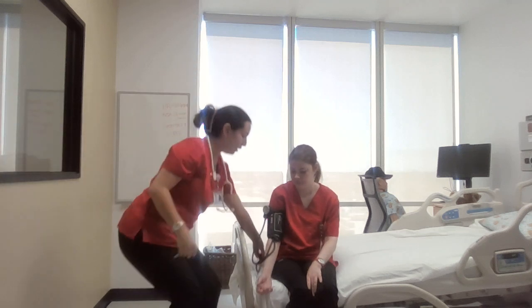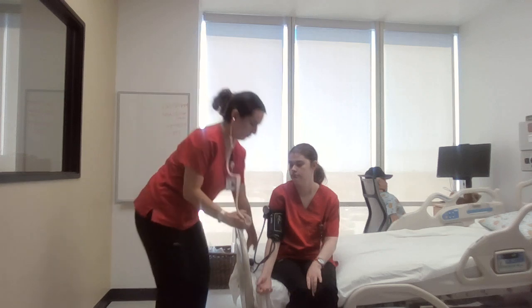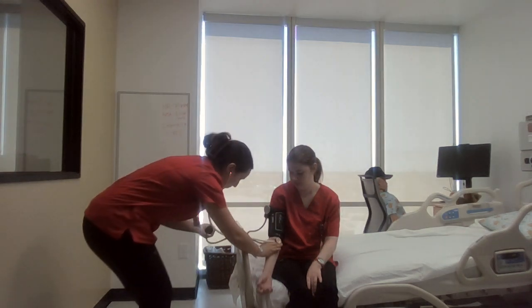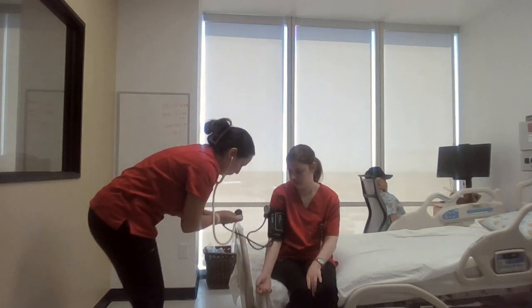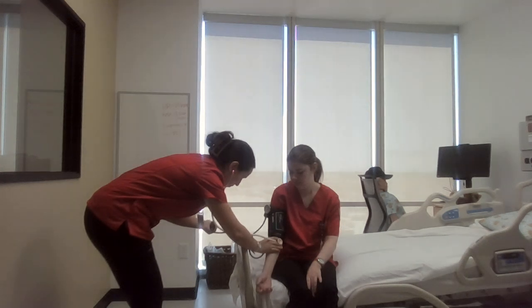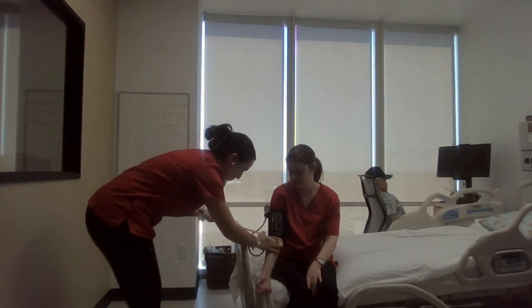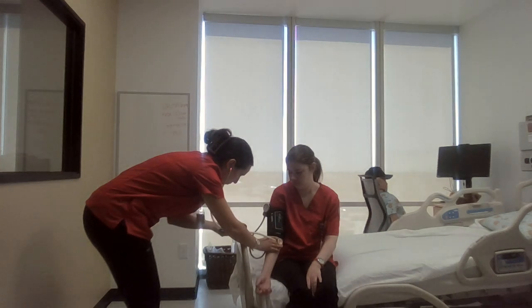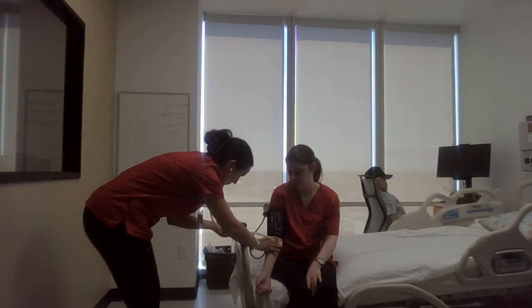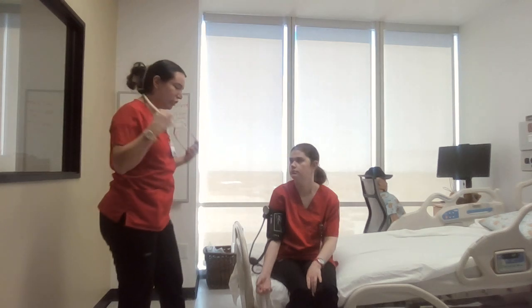And then I'm going to do the second step of the blood pressure. I'm going to auscultate the brachial artery. Okay, so the patient's blood pressure was 124/82.